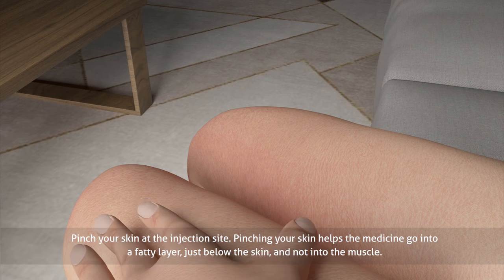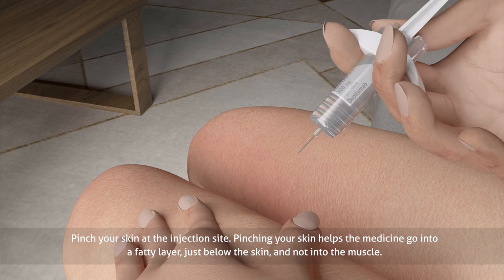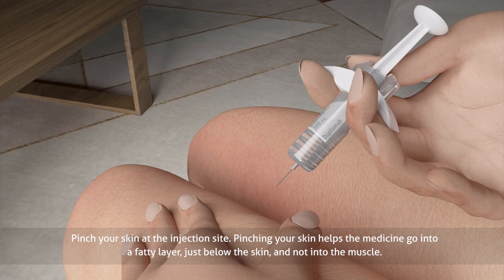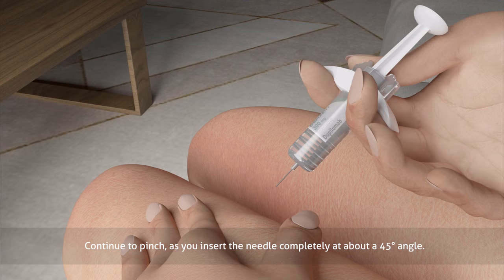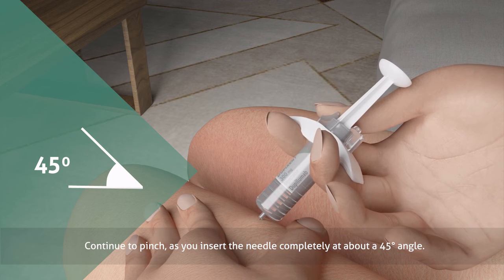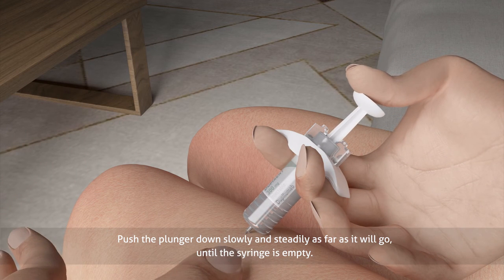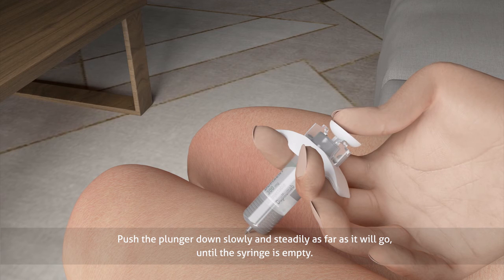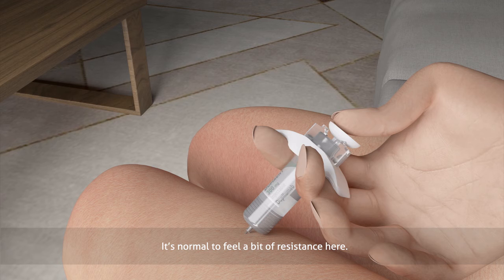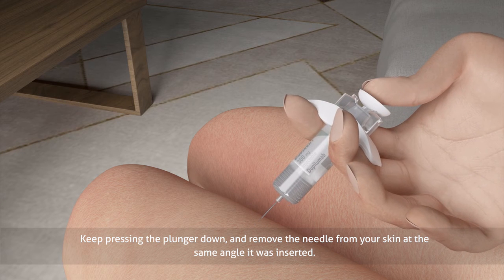Pinch your skin at the injection site. Pinching your skin helps the medicine go into a fatty layer just below the skin and not into the muscle. Take a deep breath. Continue to pinch as you insert the needle completely at about a 45 degree angle. Relax your pinch. Push the plunger down slowly and steadily as far as it will go until the syringe is empty. It's normal to feel a bit of resistance here.